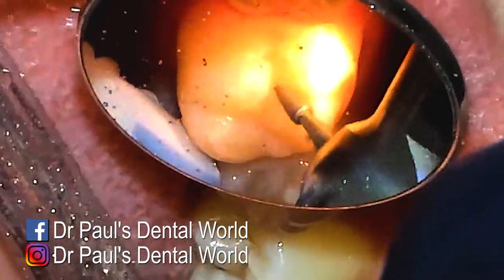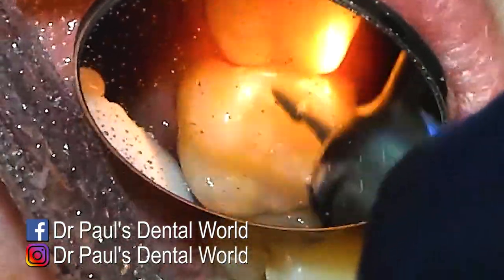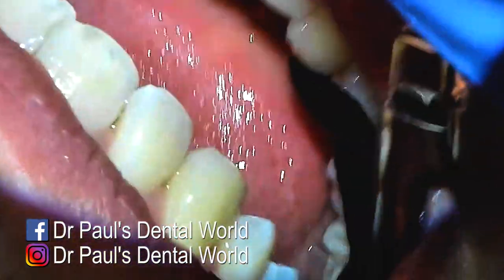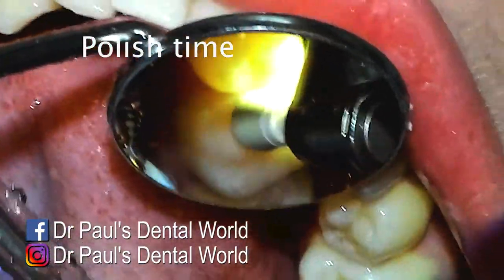I'll check again — a few little spots to adjust. I'll do most of this with that red flame diamond burr. Unless I'm way off, then I'd go back to my coarse one, but otherwise it's mostly with the red. Now it's looking really good — the main contact on the tooth is on the tooth structure itself, not on the fillings, so we're now ready to polish.